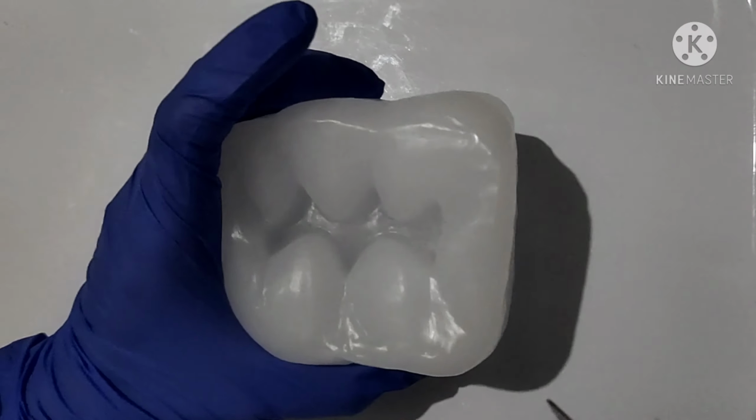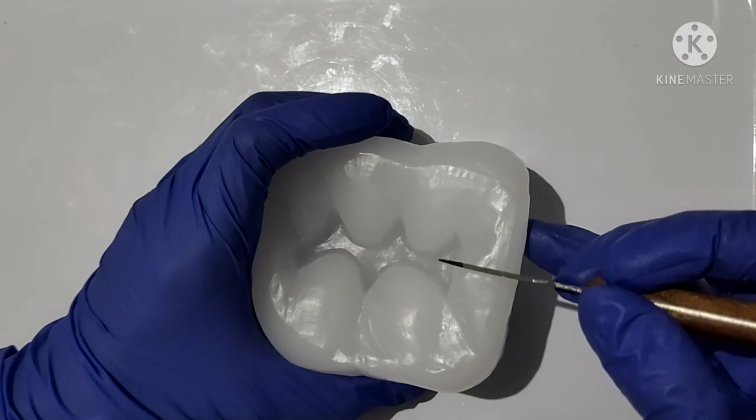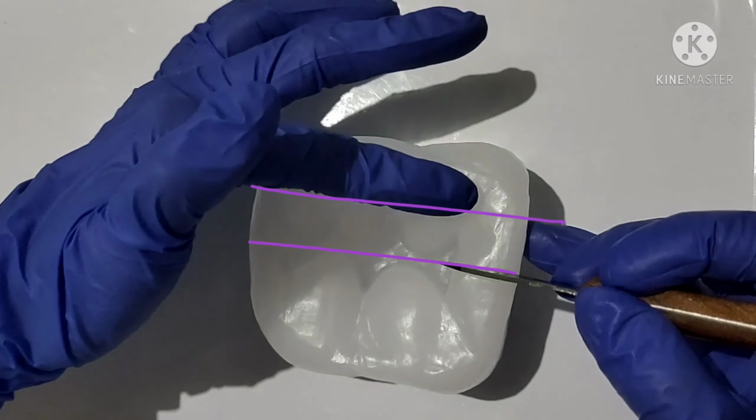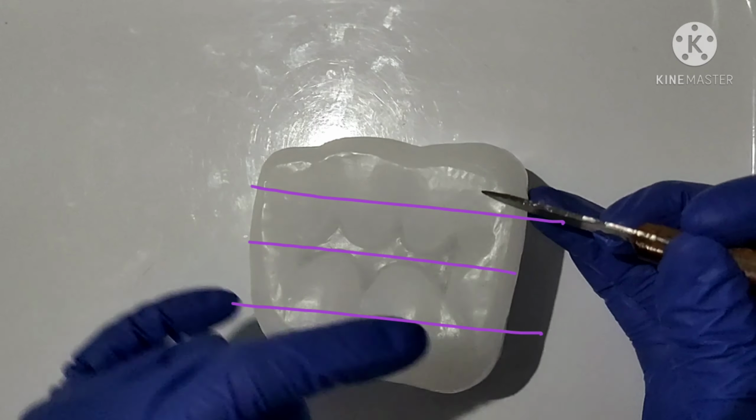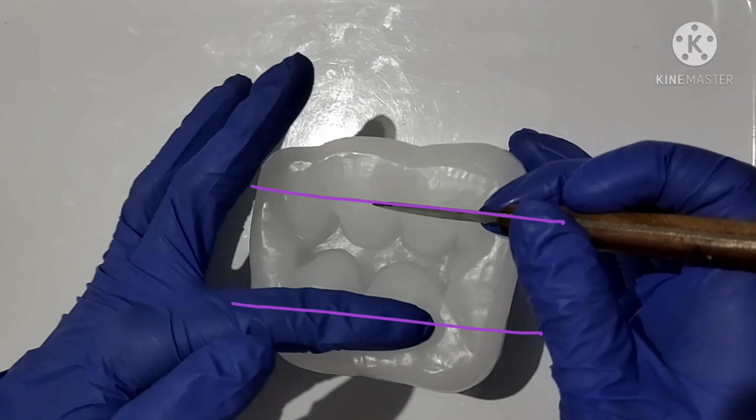For the intercuspal distance, just divide this in half. And then this half divided in half, and also this one. This line here is the exact 1/4 of the intercuspal distance.